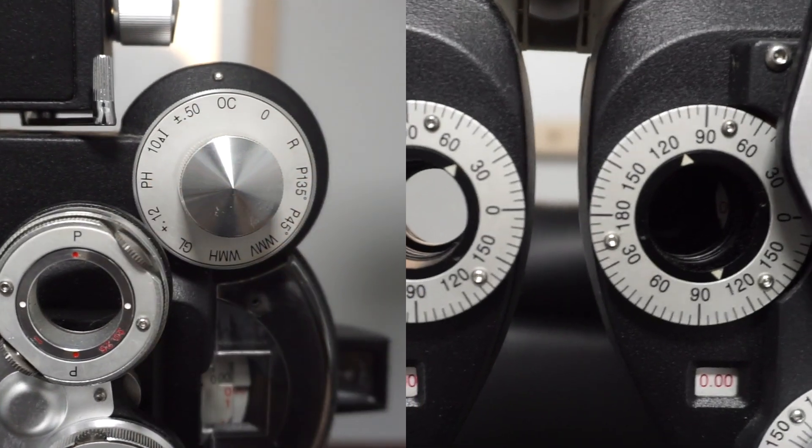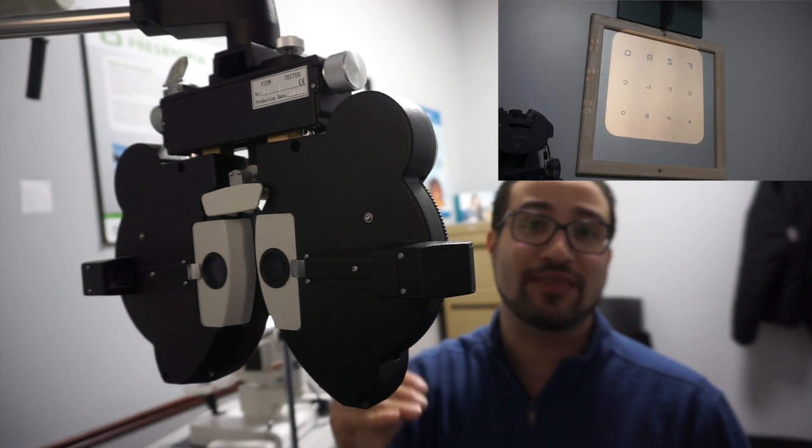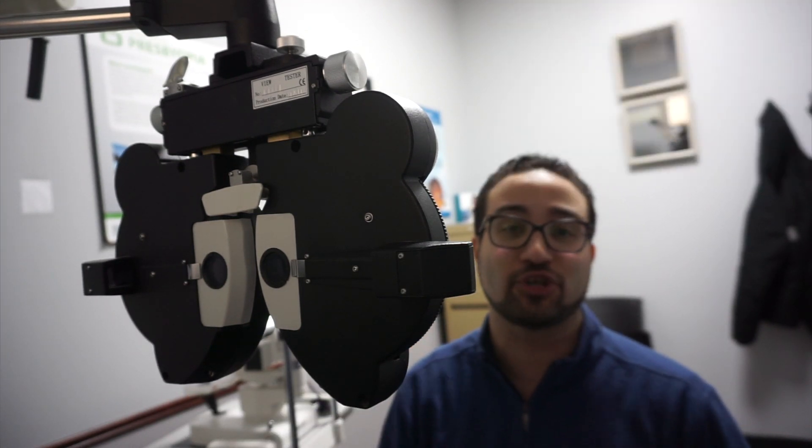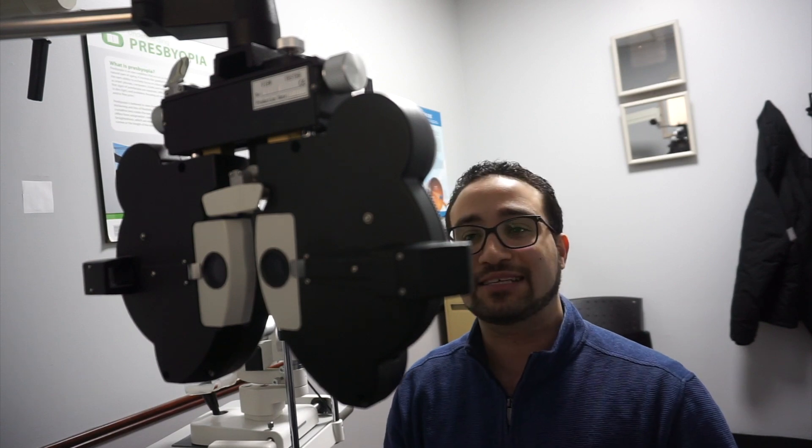What I normally do is start with one eye at a time, so we occlude the left eye. After we occlude the left eye, I have the 20/40, 20/30, and 20/25 lines shown on the screen. Keep in mind this is just a basic overview for understanding how to use this machine.